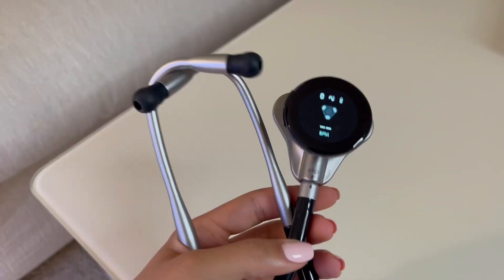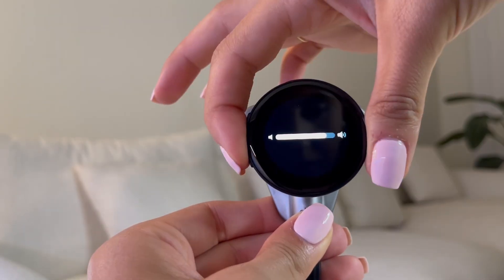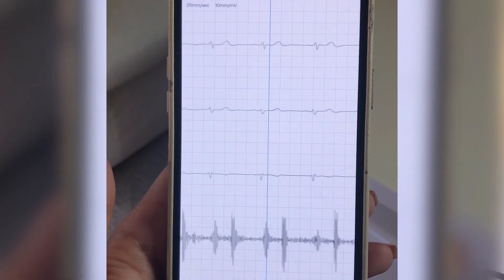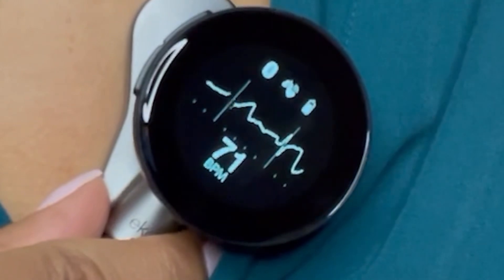There you have it — this is the Echocore 500 digital stethoscope. Its high-fidelity sound, active noise cancellation, wireless connectivity, remote monitoring capabilities, and the EKG Live feature make it a must-have for healthcare professionals. It's definitely an investment worth considering if you're a medical practitioner looking to enhance your diagnostic capabilities.